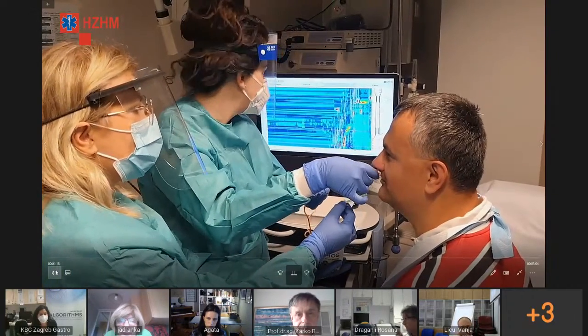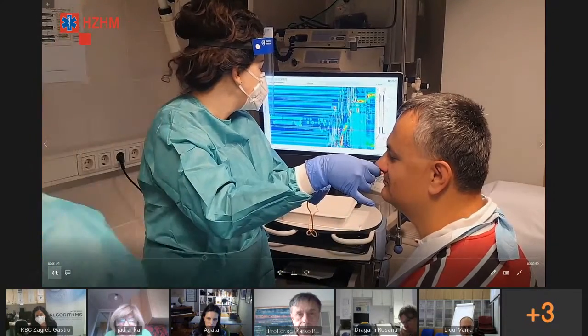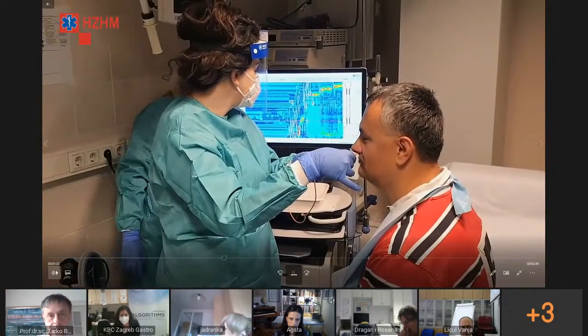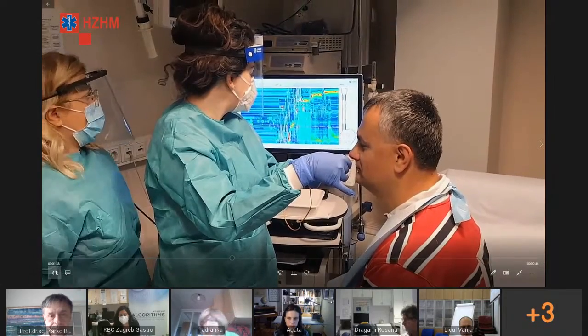Dobro, ovo je normalna reakcija. Dobro. Udahnut, izdahnut. Možemo skidati.